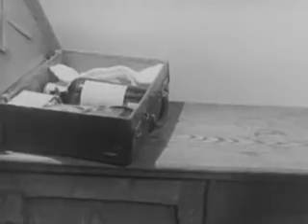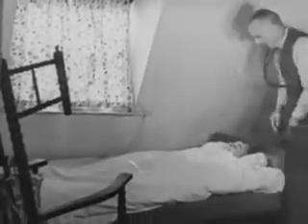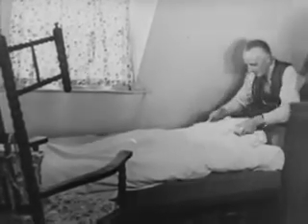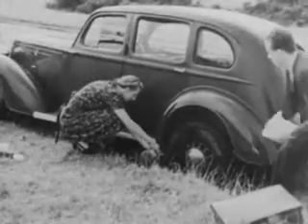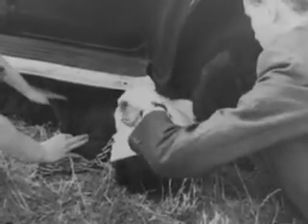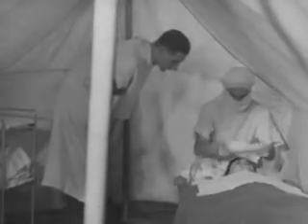The advantage of ether, as we've seen, is that it can be given with very few accessories. Every general practitioner will carry in his bag a bottle of ether, a mask, a gag, and an artificial airway. It's useful in remote country districts where there's no skilled assistance at hand. You may need it in emergency, for instance, a road accident, or as a standby on active service. Although it's a simple way of giving an anesthetic, it needs quite as much skill and attention as any more elaborate method.